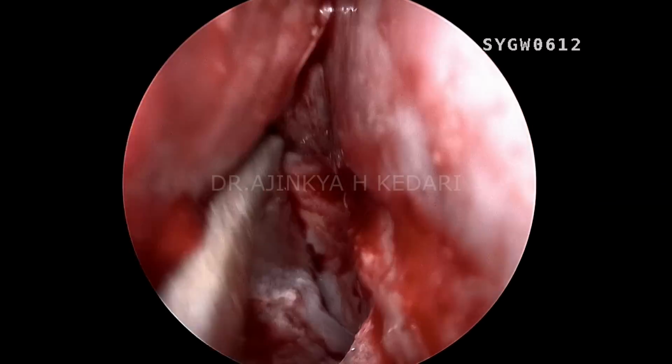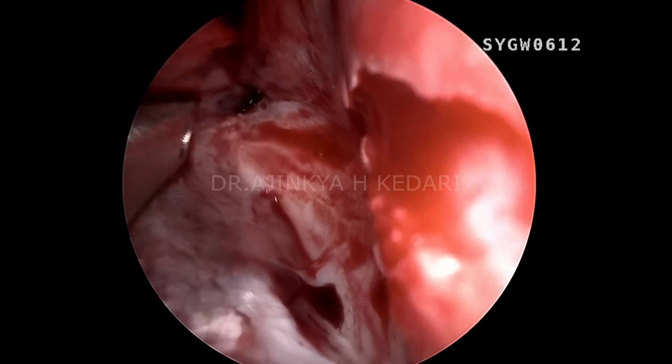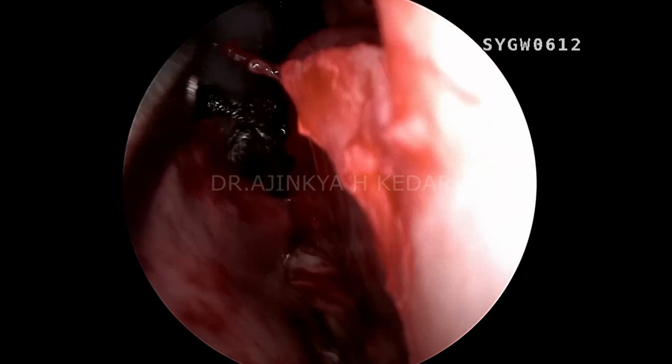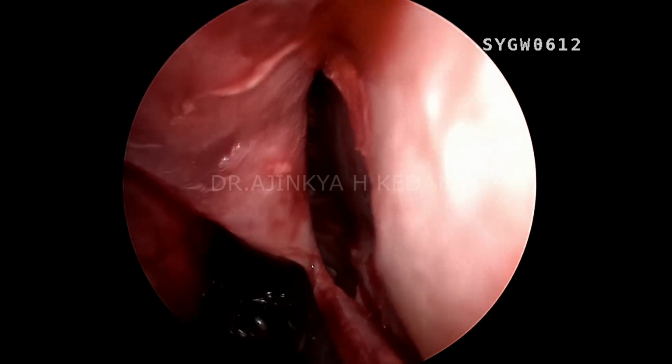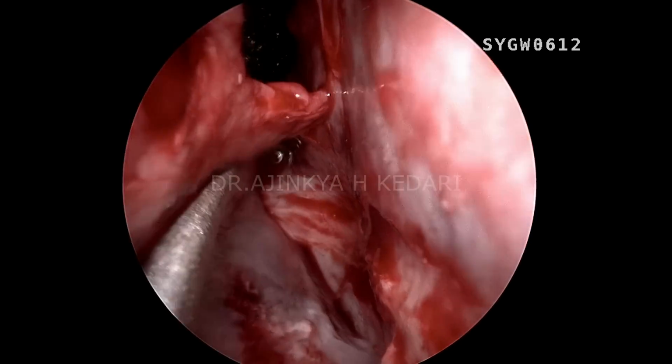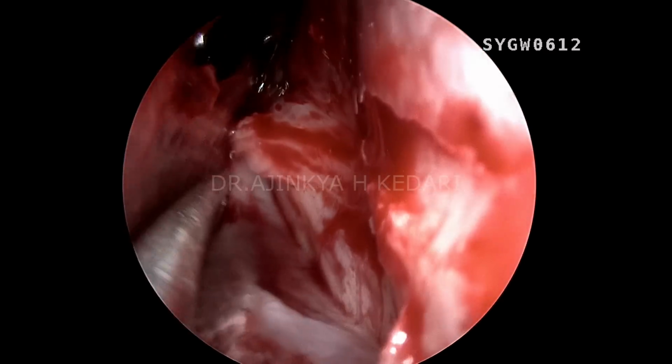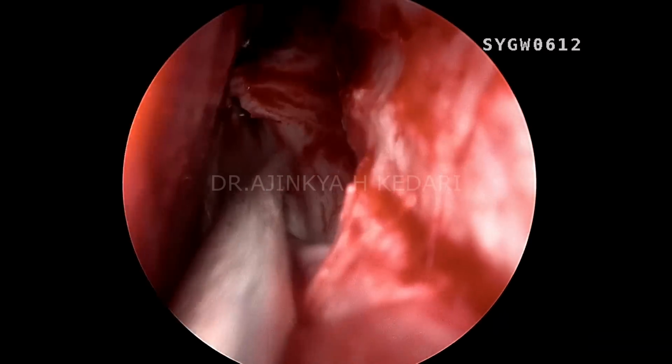You can see that's the Hadad flap. I'm trying to elevate that. That's the posterior most aspect of the choana. You can see that's the superior window I had taken for the binostril approach. And carefully dissecting it, that's my superior incision done. And that's my inferior dissection.